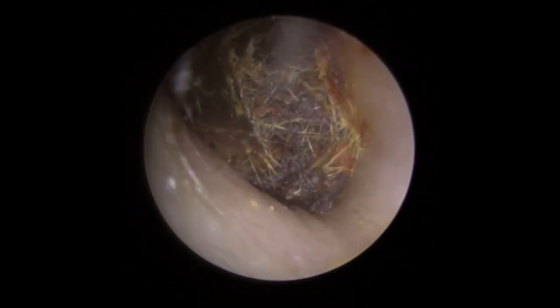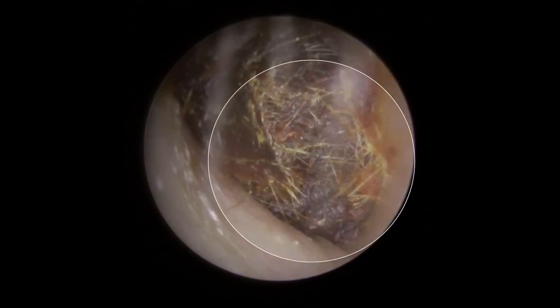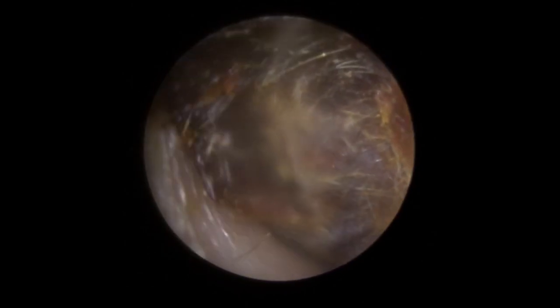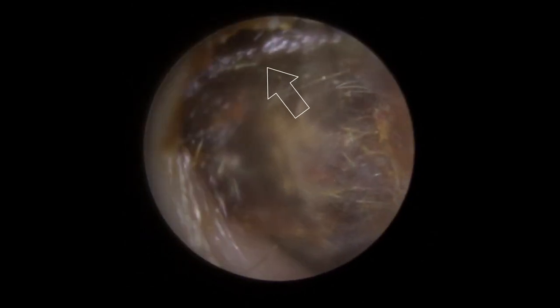Hi everybody, this is Rhys Barber from Audiology Associates. We've got classic Q-tip use here. We can see that this section of the wax has been very firmly pushed into the ear canal. And we know it's Q-tips because we've got that domed end to it. We can see that this section of wax is much closer to the outer part of the ear canal, giving that domed, pushed-in central appearance to the wax.